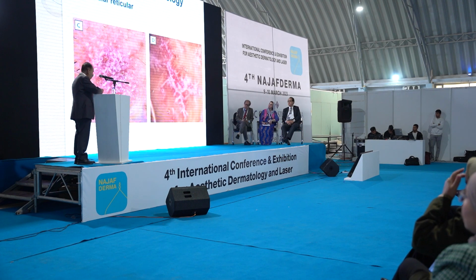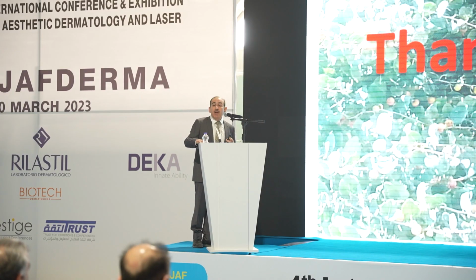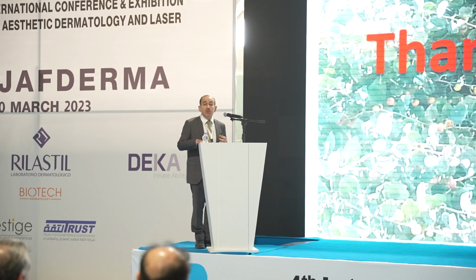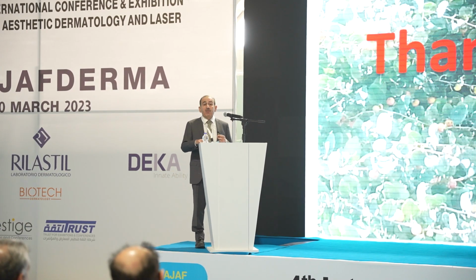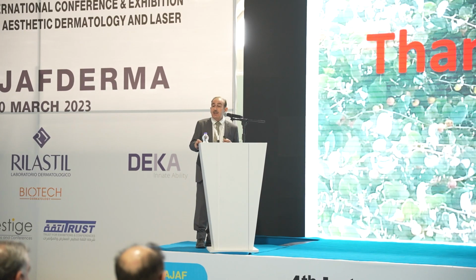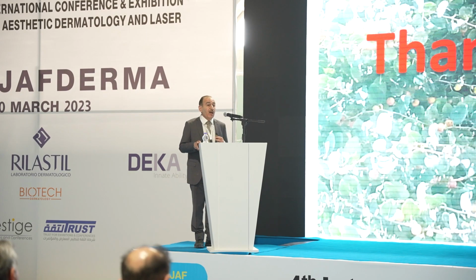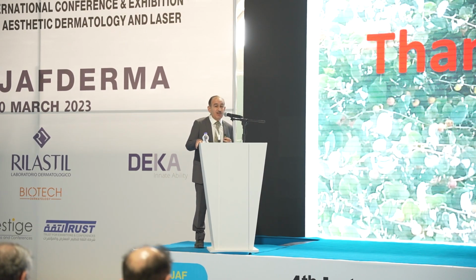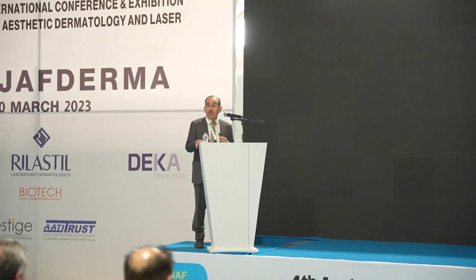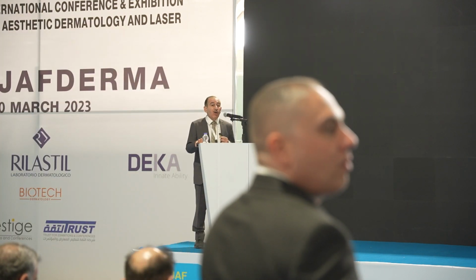So, in conclusion, we can say that in many cases that are unusual or difficult to diagnose, common inflammatory diseases like psoriasis, eczema, and lichen planus, dermoscopy has an important role in differentiating these important and common entities, and will save us the time and effort and the expense of doing a biopsy.